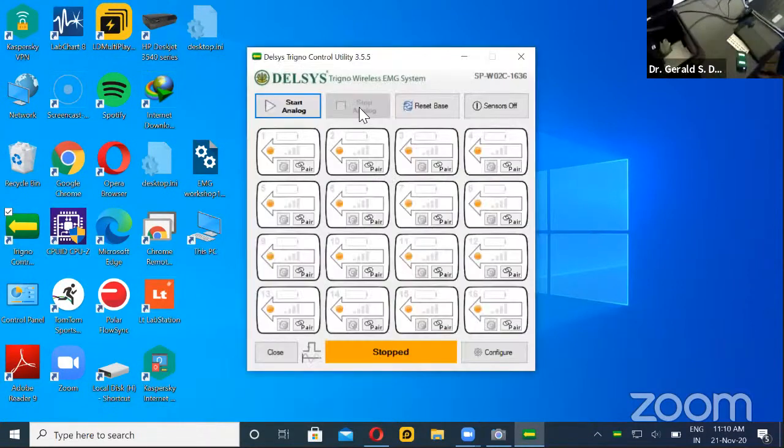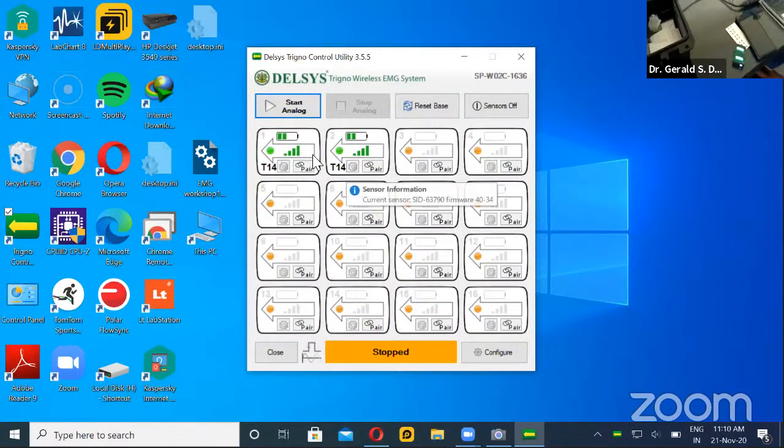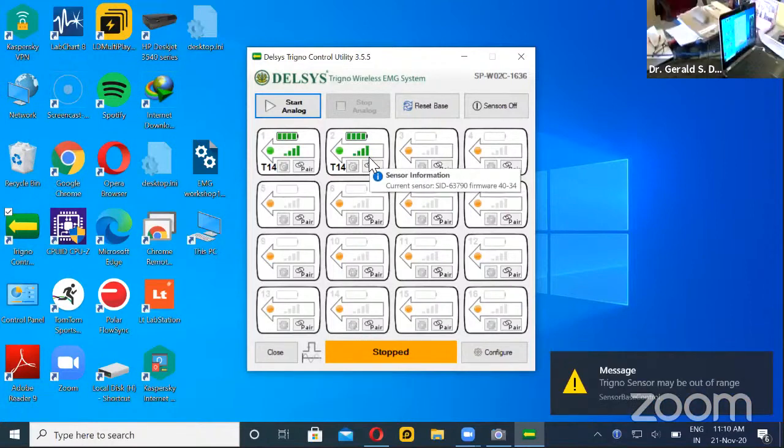The Trigno utility has started and it is pairing. Since there are only two sensors, it has already automatically paired. The first time you pair, you'll have to do some initial settings, but since we've already used this, it has automatically paired. So now the sensors are paired.